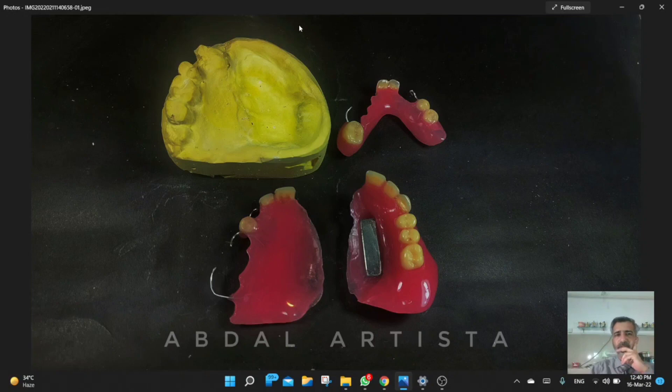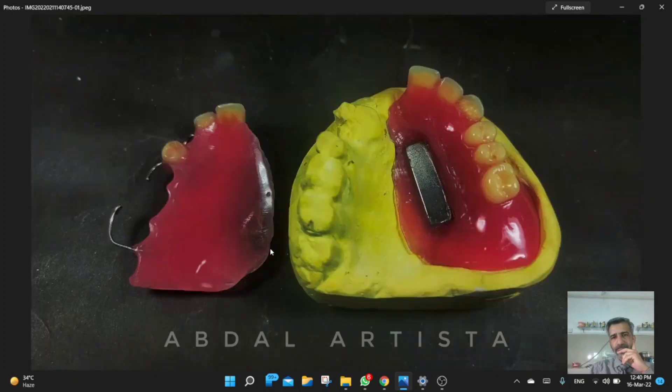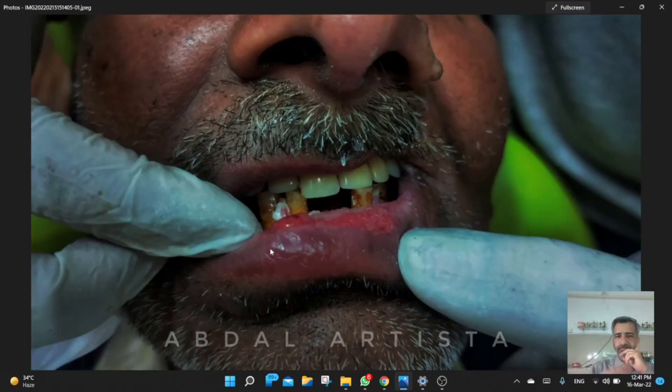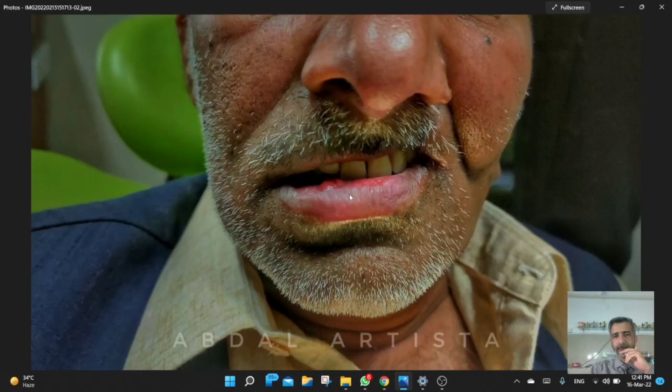If you look closely here is the hole that was created — a bit of acrylic removed to reduce the weight of the prosthesis. This is the final prosthesis; this is how it looked. This is the insertion process. Spot grinding was done later on, and this is how it looked — the frontal view. We had to accommodate the limited mouth opening, and this is how we fabricated this prosthesis.